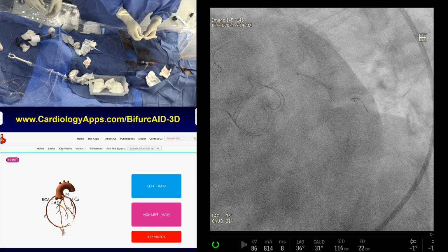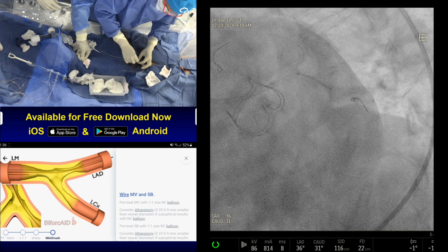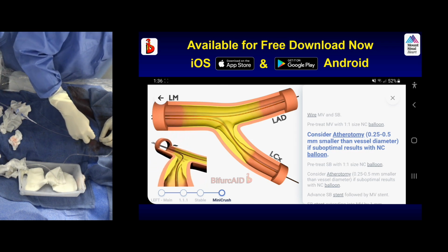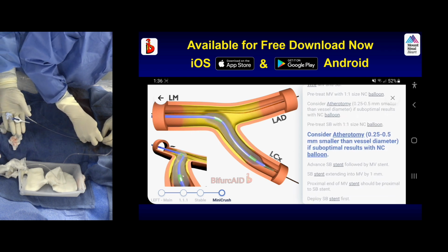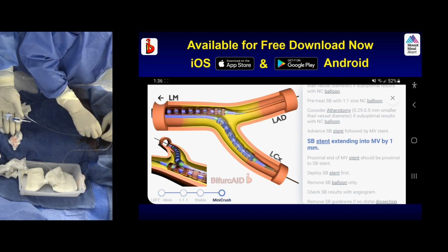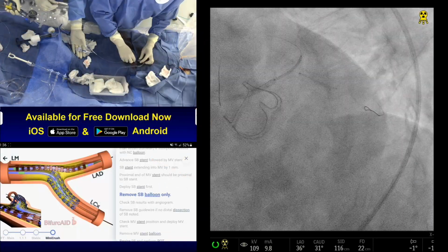We are actually working on the various strategies at one center: mini crush, DK crush, culotte, or TAP. TAP is one way, but I would say it is the same, that you're putting in one stent, then going with the second. So the best is that once you decide, get better with either DK crush or mini crush. We actually have no hesitation using the mini crush in most of our bifurcation lesion subset. Yes, so it's a classic mini crush. It's not a nano crush where you have to recross and all, but a mini crush. Not a big one, not a macro crush or what used to be the classic one, but just a little bit.